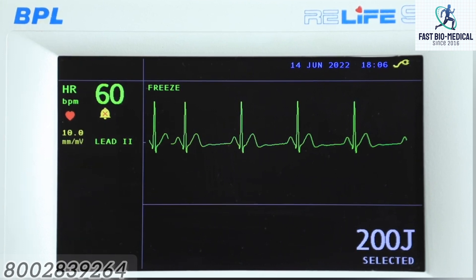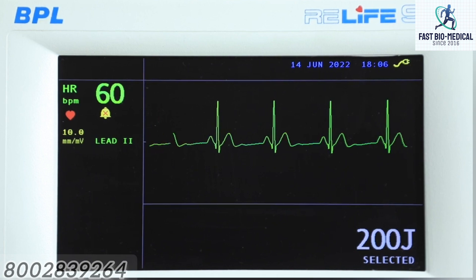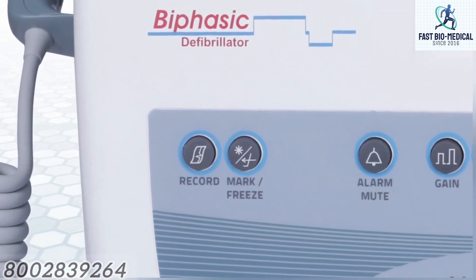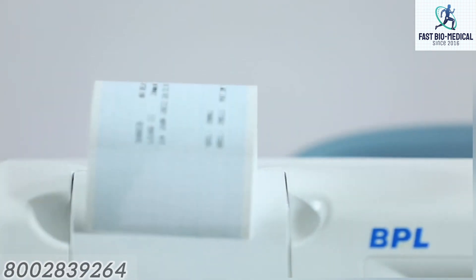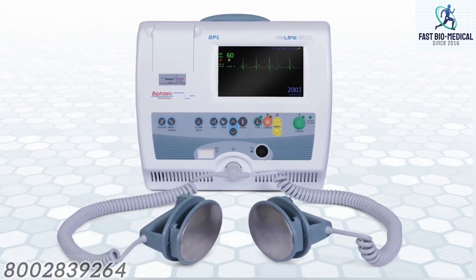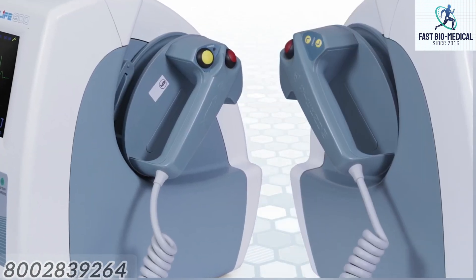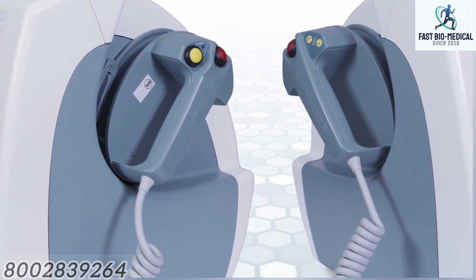Pressing the freeze key again will remove the freeze condition. Record key: this key is used for record functions. When pressed, the recorder starts printing the present ECG data and status. Pressing this key while the recorder is printing will stop the printing. Shock: initiates transfer of energy to the paddles. Two keys are present, one on each paddle; both keys must be pressed simultaneously and held until the shock is delivered.